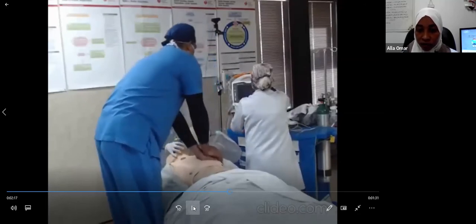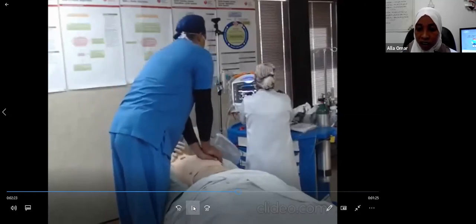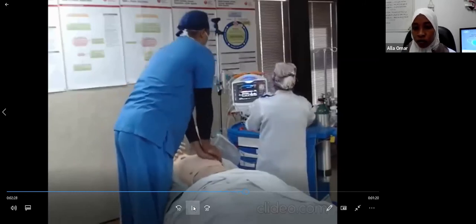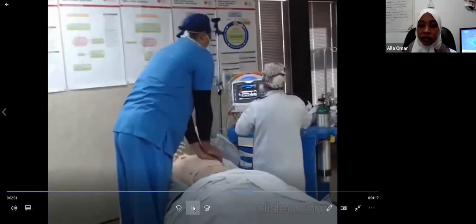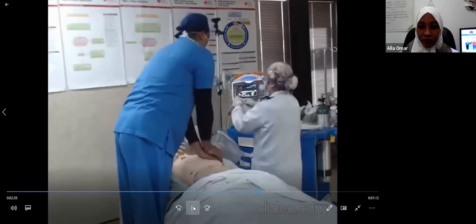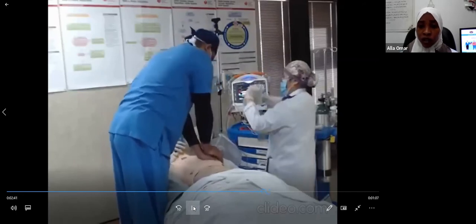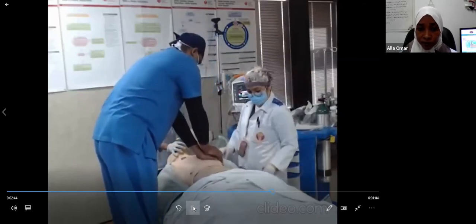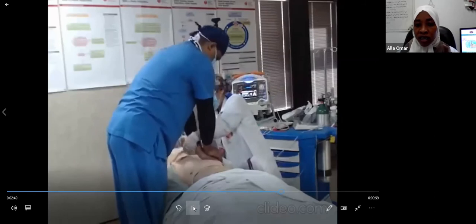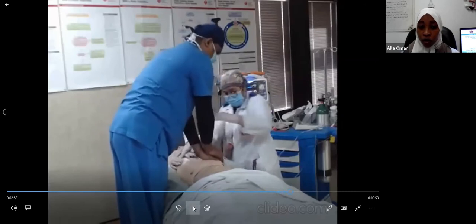Lastly, what is she doing? She powers on the AED mode. Good. And as you know, the AED will give prompts on what you have to do next and next. Now she is opening the pads, preparing to attach them. And sure, as you know, for the pads, there is always a diagram for those who are not seeing it in low volume areas.